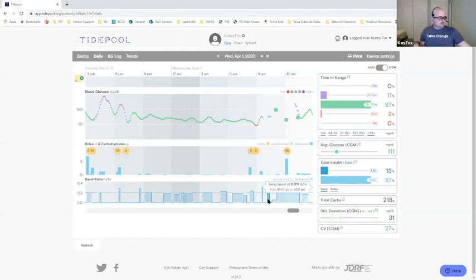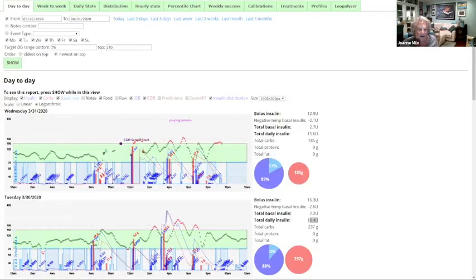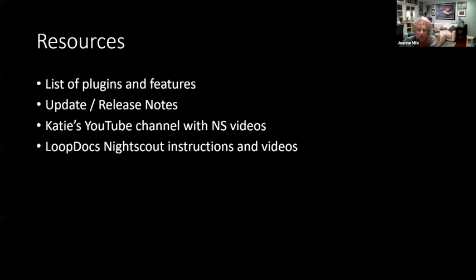You guys listed a bunch of stuff for me earlier that you wanted to make sure was covered. We talked about Tidepool. I posted and you had a great webinar. A lot of this ends up being what reports do you like to look at and what's useful, and the endos, if they can. You're training your endo.